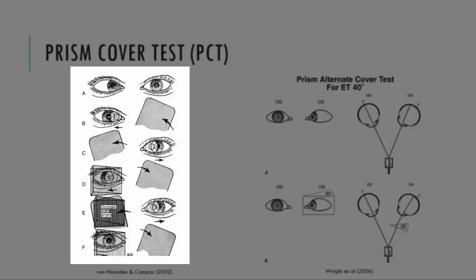So, what do we mean by this? Here, when you cover the left eye, you see the eye move out to take up fixation. Now, when the prism is put in front of this eye, you will reduce the amount of movement. And at the point which you find the prism that equates to the size of the deviation, there will be no more movement of that eye.